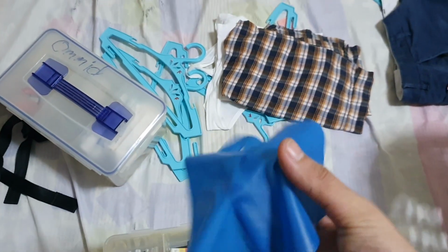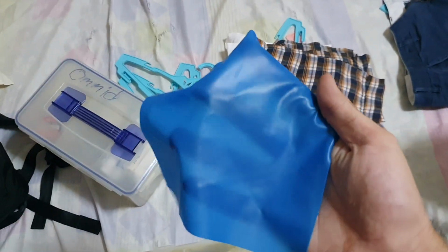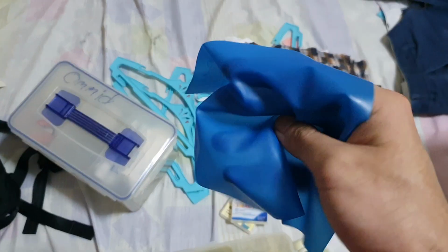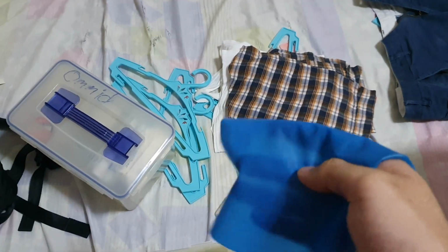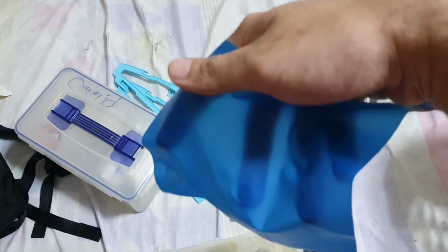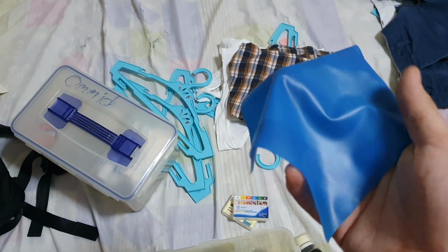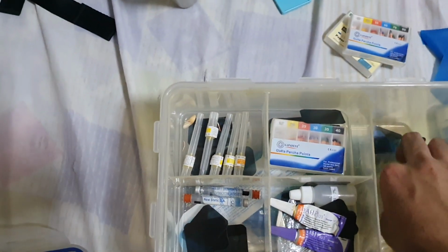And this is the rubber dam sheet. If we're going to do any root canal, you will put the rubber dam sheet with the rubber dam frame onto the tooth to prevent bacterial or saliva contamination of the tooth that you're working with.